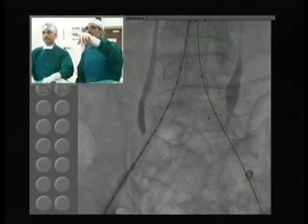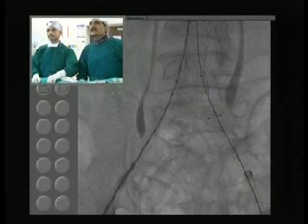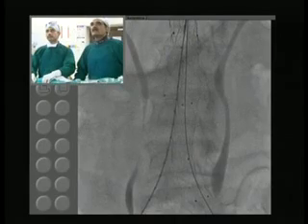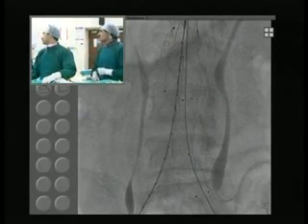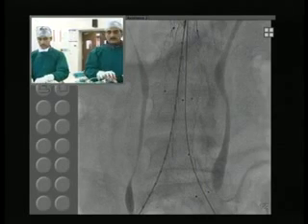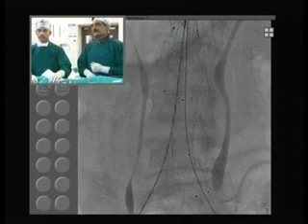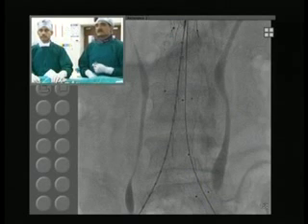Okay, 1, 2, 3, 4, 5, 6, 7, 8. 8 to the top of the screen. 9, 10, 11, 12. 12. So we'll need a 120 millimeter device. Yeah. So this device is 16 on top, where it will mate with the contra gate, and then it will be 20 at the bottom.